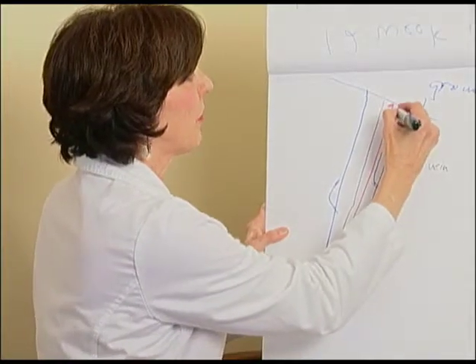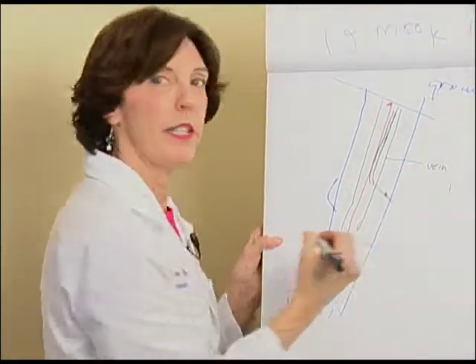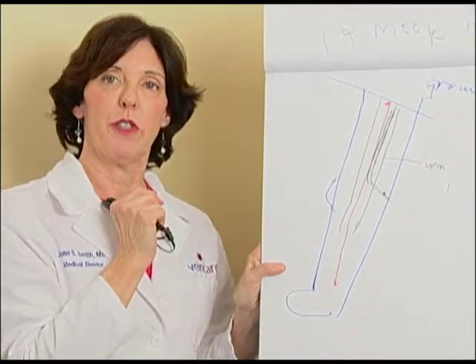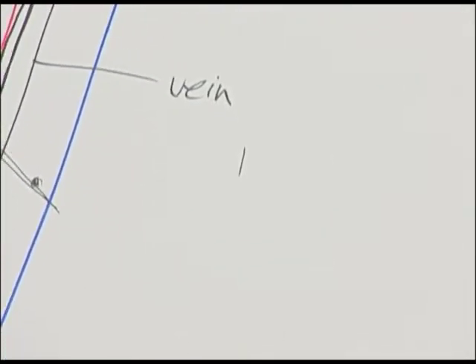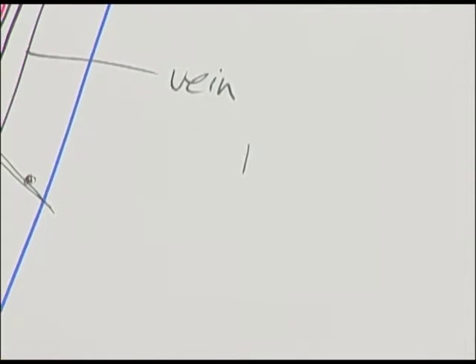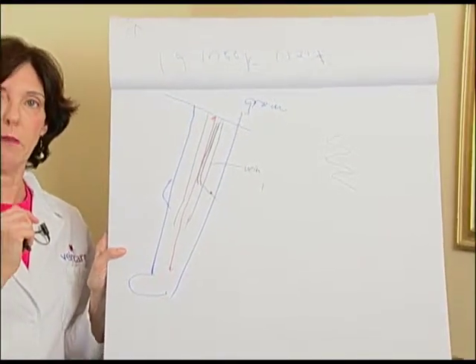Now, I always do this wrong, so bear with me. Now, the laser filament is, and I just showed one of my kind assistants here what it looks like, and that's actually bigger than the laser filament. I'm not even sure it'll show up on the camera, but it's teeny. Every time I do this procedure, I'm amazed that something that small can generate enough heat that will close down the veins. Now, when you look at a light bulb, you'll see a jaggedy filament. That's where the light comes from. That's where the heat would be generated. This filament does the same thing.